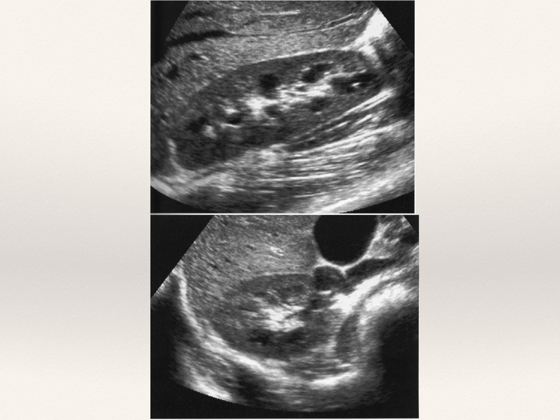Anyone? Air. One vote for air. Any other votes? Okay, so I'm going to go with bed. I'm going to suggest you rotate down to the bed. And the reason is that's going to give you basically the same mental picture of an axial cut through as if you're doing a CT scan of just that right side of the body. When you're on the left side, you keep it pointing up to the air. But on the right side, it's pointing down toward the bed. And we'll look at that on a patient before we start scanning, okay?